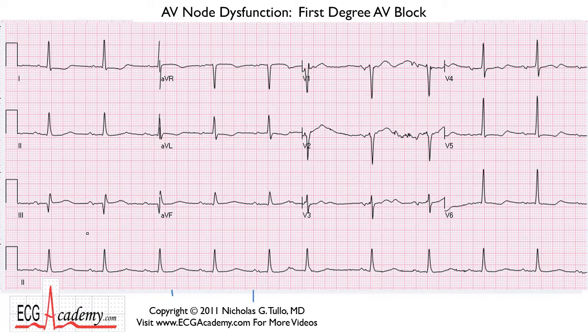If you look over this cardiogram, you can see there's a slight irregularity in that the QRSs do seem to march through, but then this beat comes somewhat early. You can see that this beat, if you had mapped it out, the normal beat would have occurred here. Instead, this beat comes a little bit early. We're going to talk about ectopic beats in a later section, but this happens to be an atrial premature beat because you can see a P wave that conducts to the ventricles. The P waves in front of all these beats are quite obvious. Following this premature beat, there's a little bit of a pause, and this interval is a little bit longer than the underlying heart rate.